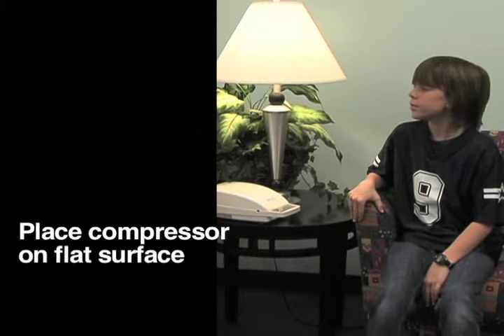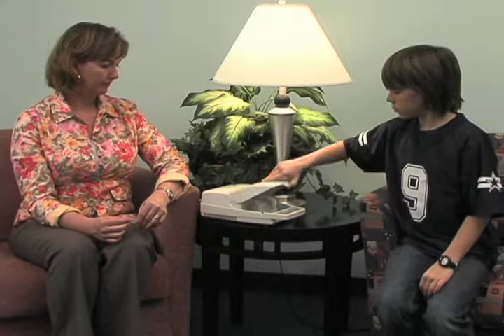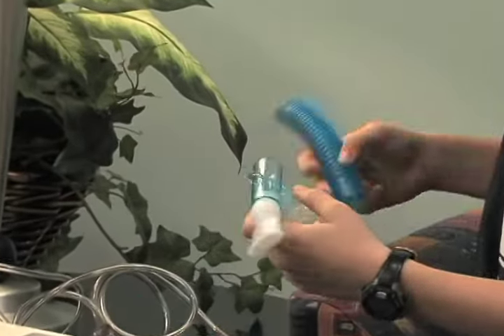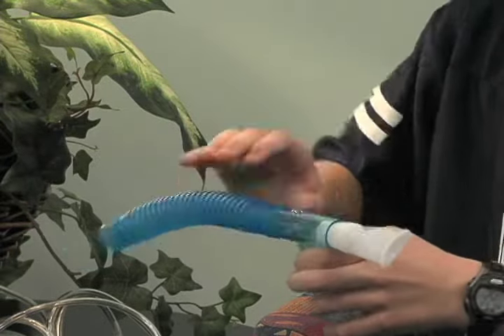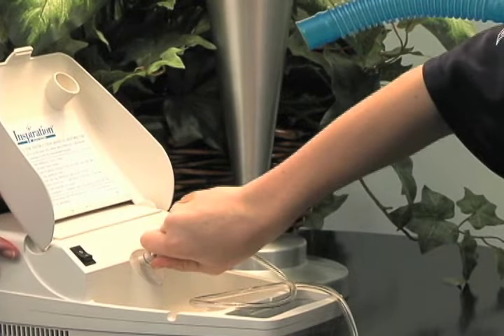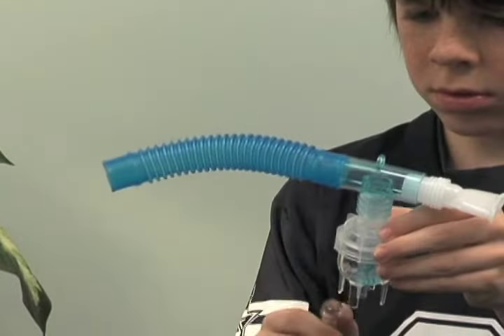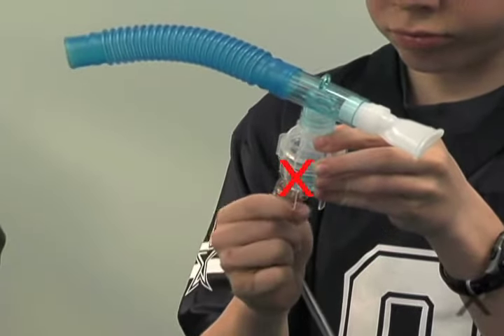Place the compressor on a flat surface near an electrical outlet and plug it in. Open the nebulizer kit and assemble. First, attach the T-piece assembly or mask to the nebulizer cup. We will talk about the difference in just a moment. Take the air tubing out of the package and connect this to the compressor. Now connect the other end of the air tubing to the bottom of the nebulizer. Be careful to plug this into the hole in the bottom of the nebulizer and not onto one of the legs of the nebulizer cup.